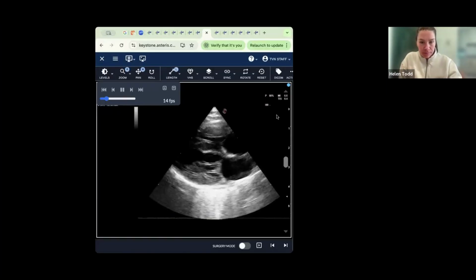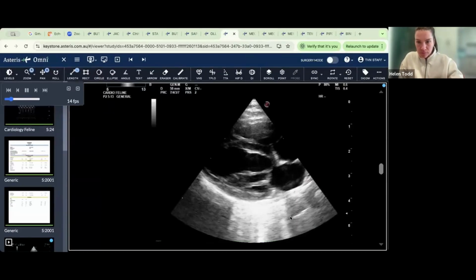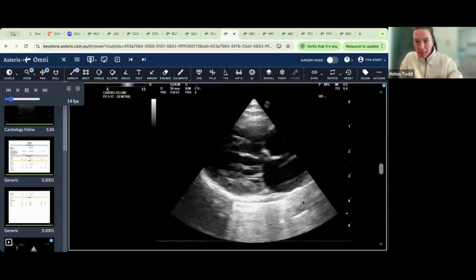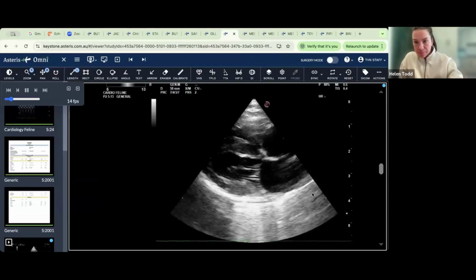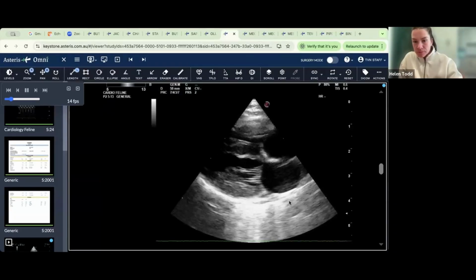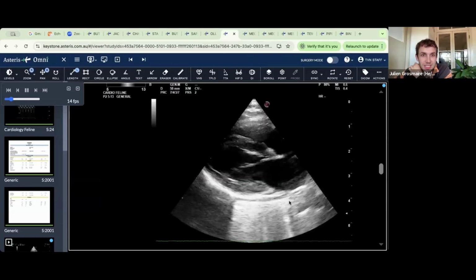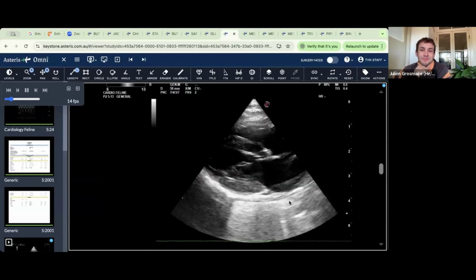Ooh. All of this. Do you mean like the hyper-echoic background at the bottom? Yeah.